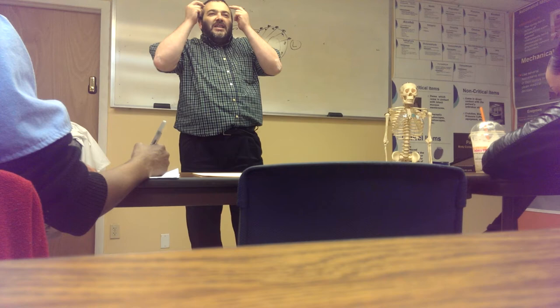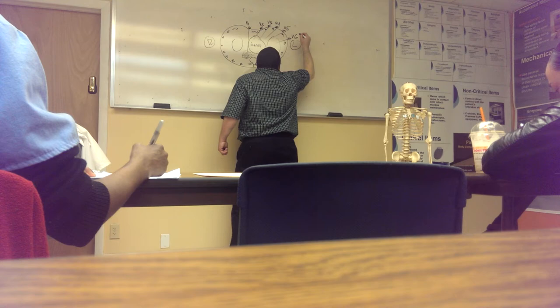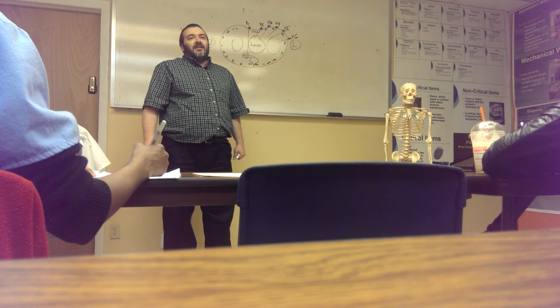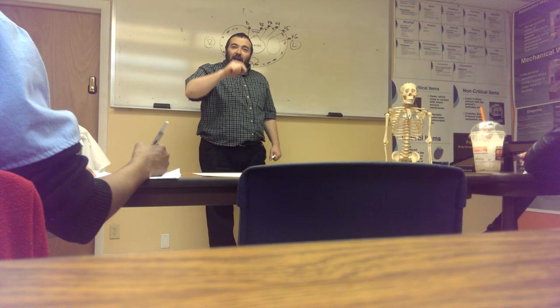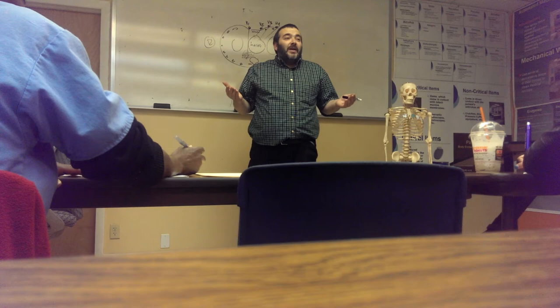This would be V1. V2, V3, V4, V5, V6. How many stickies did we put on? Six. How many stickies did we put on before? Four. How many altogether? Ten. How many views did we get? Twelve. Did you catch that? Yeah. So, 10 stickies, 12 views. Science, ladies, science. Do we need to know the science? No.